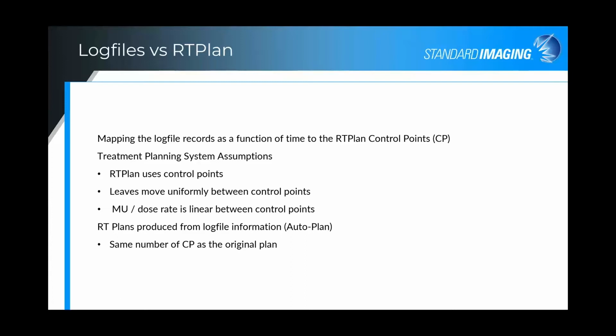I already mentioned that the same fluence can be performed based on the RT plan, such that a direct 2D fluence can then be analyzed using the traditional gamma analysis between the planned and delivered treatment. The RT plan specifies delivery based on control points, and only at these control points is the configuration specified.